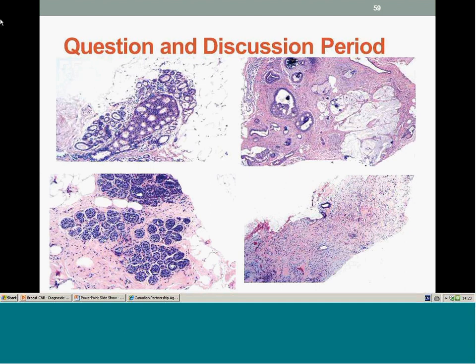Generally, I don't do myoepithelial cell markers routinely. There is variation in our group practice. Some of our junior colleagues seem to order it on everything. I think it's a waste of money. I do E-cadherin on ambiguous lesions, morphologically that sort of an intermediate grade.